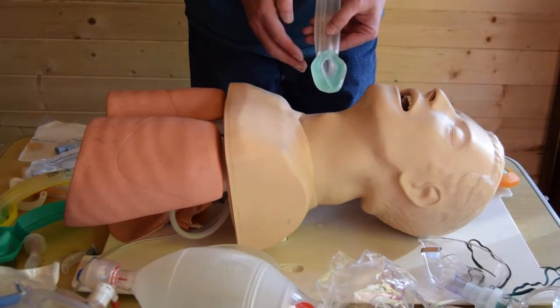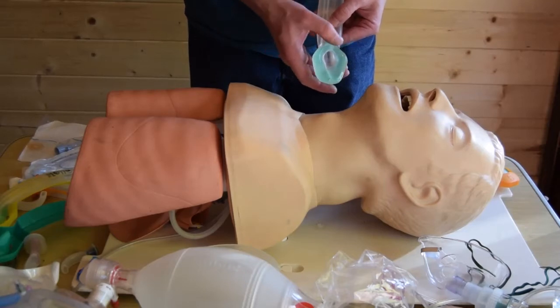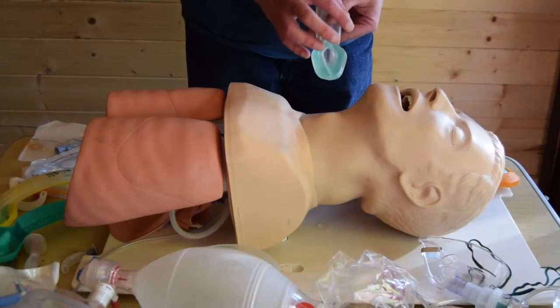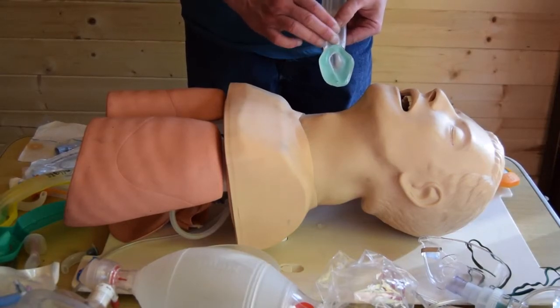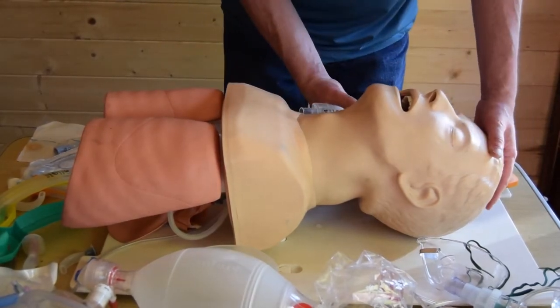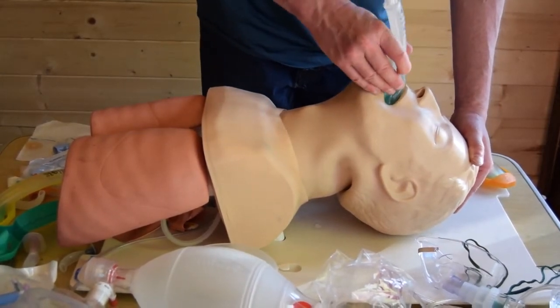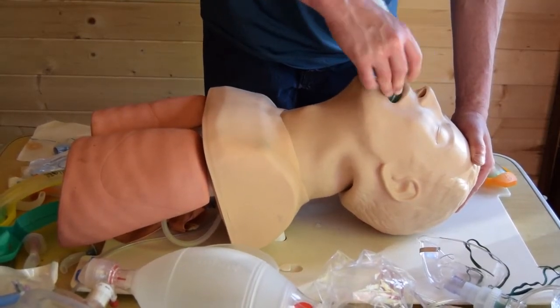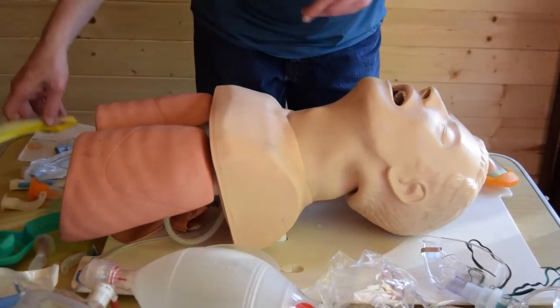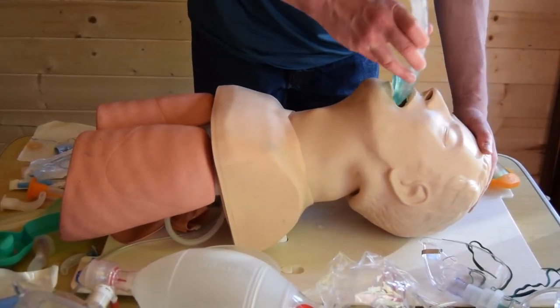The i-gels are particularly important, and they're very clever in their own design because the mouthpiece or the throat piece actually changes shape with heat. So the heat of the body will help mould that to fit the back of the airway. If I do the head tilt chin lift again, these simply slide down the throat. What I'll do for this one is use a smaller one just for illustration purposes, because he hasn't got a very big mouth. Okay, so this one slides down the throat.